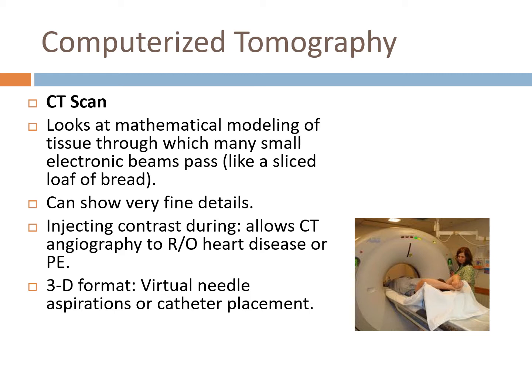So the nice thing is that they really have advanced the technology of the CT scan, so it literally takes longer to get the patient down there, to move the patient onto the table, to get everything situated than it does to actually do the scan itself. The scans are really, really quick now. Basically a CT takes slices. It's high resolution pictures, 1 to 2 millimeters thick, so it can show very fine details.